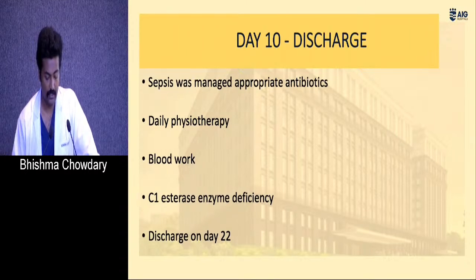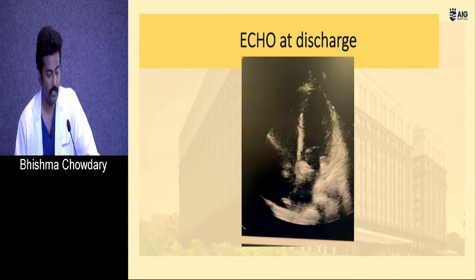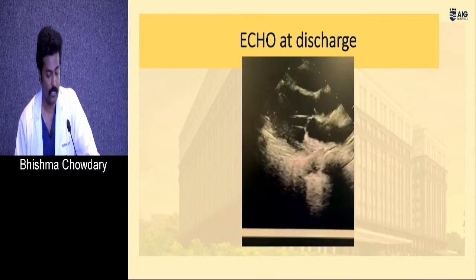On day 22, she was discharged. She went home walking, and this was the X-ray at discharge. This was the echo at discharge, almost back to normal.